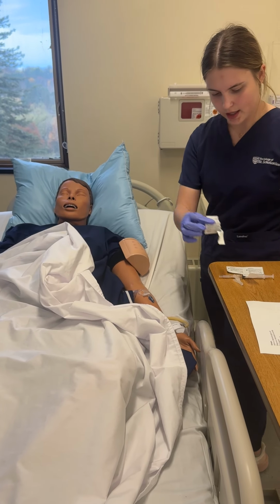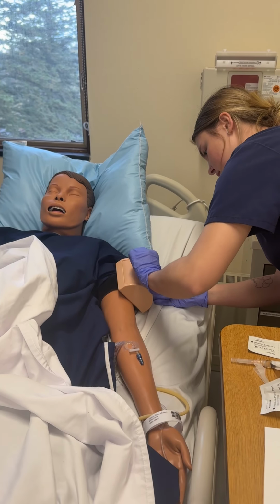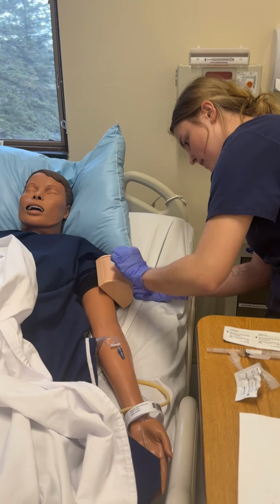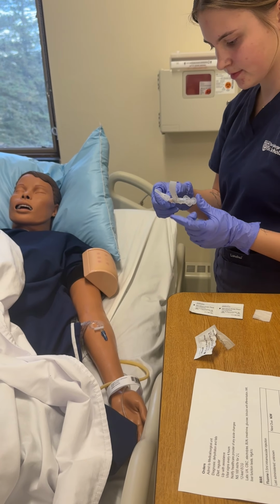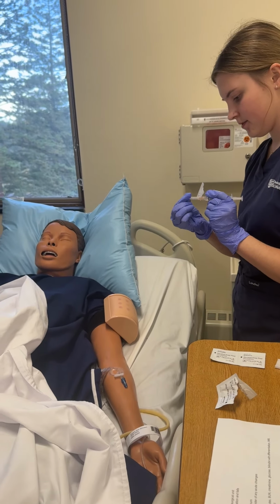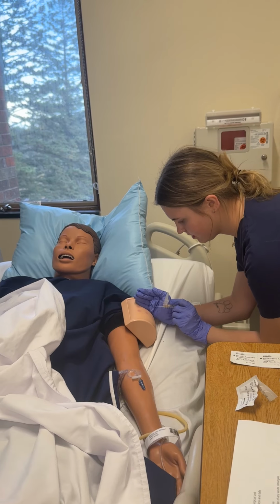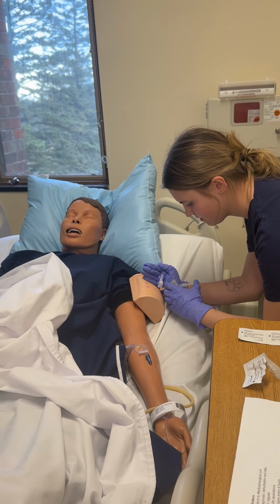Okay. All right. So first, we're going to disinfect your arm here. And we're gonna let that air dry for a second. Okay. We're gonna take this off. We're gonna move the skin over, and it's gonna go straight in at a 90-degree angle.